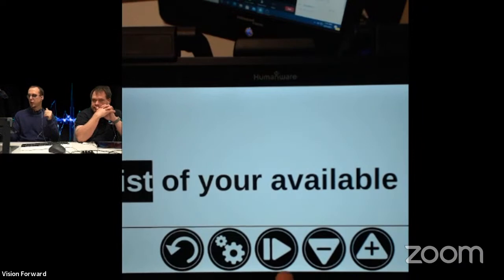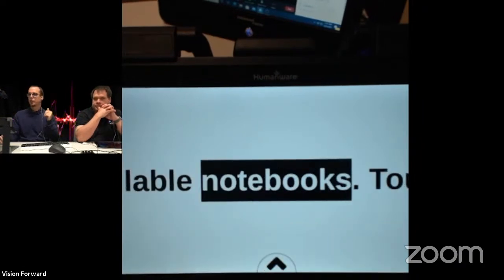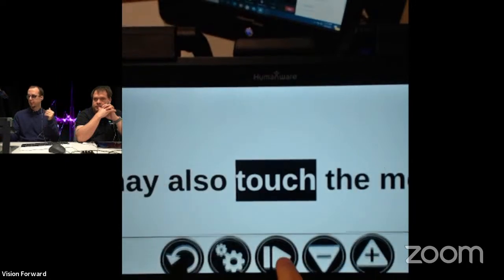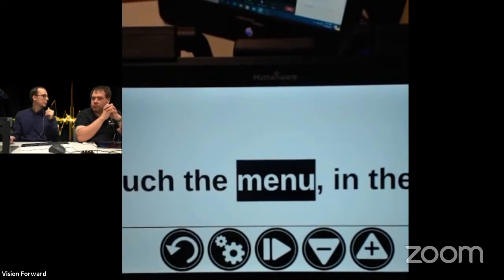Yeah, so I've just changed it to line mode here, so we can see everything's in a line. Are you able to adjust where that line of text is? As far as I know, no. It will be displayed centrally. So you'd have to visually move. Exactly, just move your eyes.